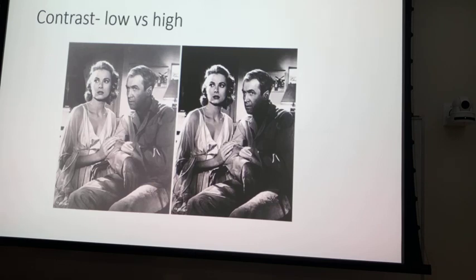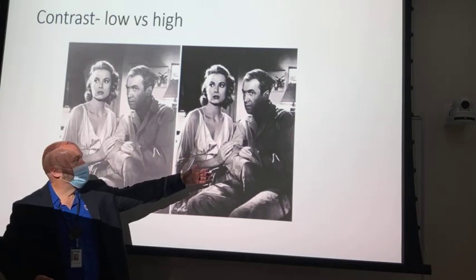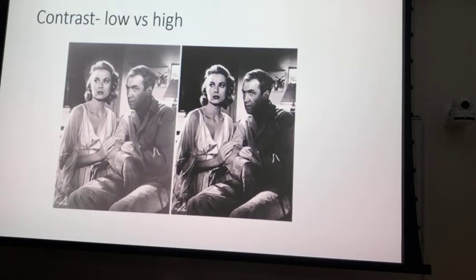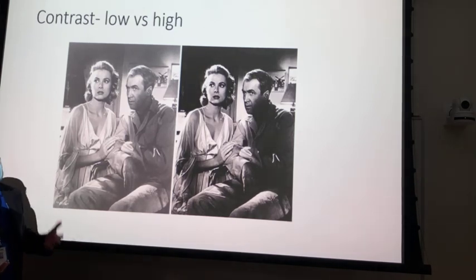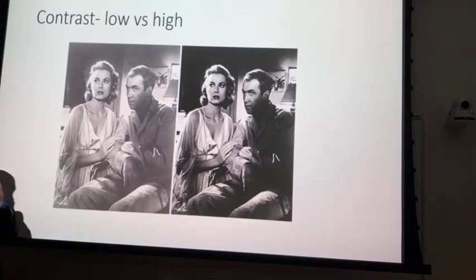So in contrast, we've got long scale contrast, gray. We've got high contrast, and stark differences, right? So we have to have both, really. You can have an image that has way too much contrast and you can't really make a good diagnosis off of it. And then we can have an image that is so gray that we can't really make any sense out of it either. So we have to have a balance between the two. We have to have grayscale, we have to have contrast as well. So there's a balance between the two.